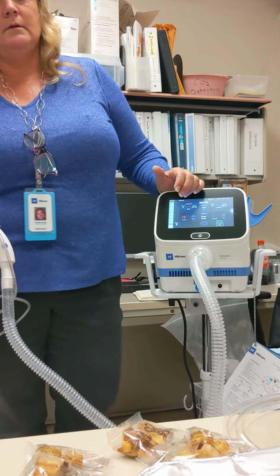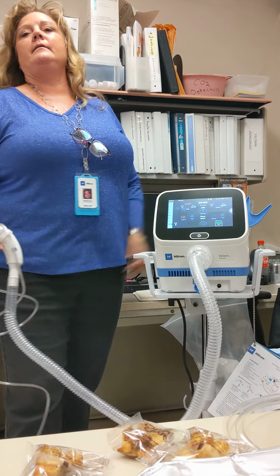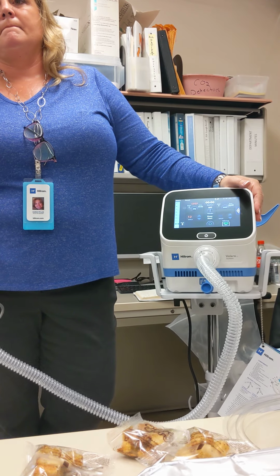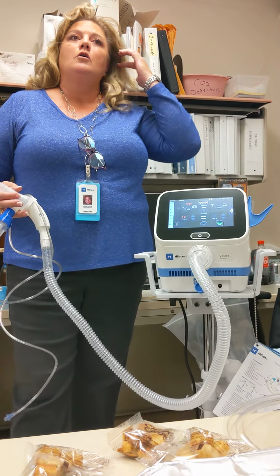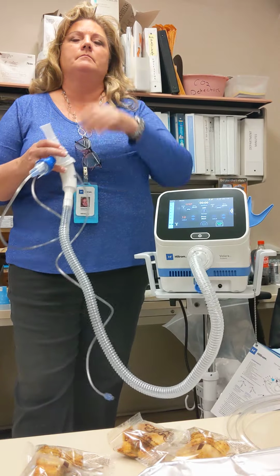On an adult. You do peds? Peds are 10 to 14. And we would never do this on a neonate, right? You can. I'm not going to suggest it, but I don't know that we would do this on peds here. Our peds is more observational, and we would use a mask.